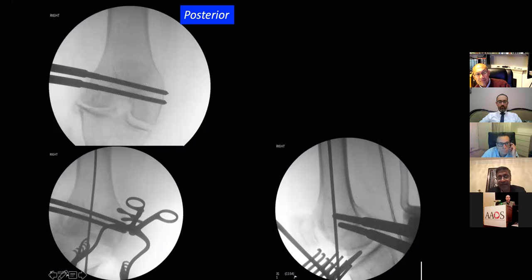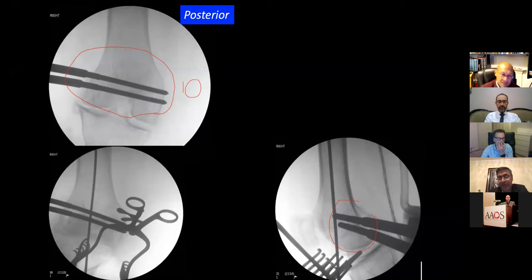And again, as you can see, the pins are posterior to the plane of the nail. Now this is quite important, how you put these pins. Mr. Nayagam shows beautifully in his talks, and you must remember that the anatomical axis is about 10 degrees off the mechanical axis. So you have to put the pins in the planes appropriately, because you may end up over correcting or under correcting it. So you need to decide which plane you're going to put your pins in and correct appropriately. And that way you can get the appropriate correction.